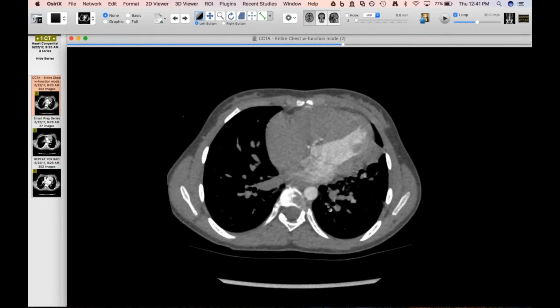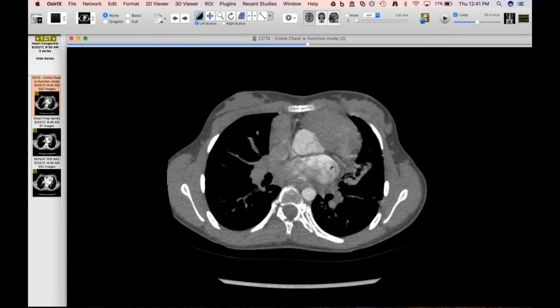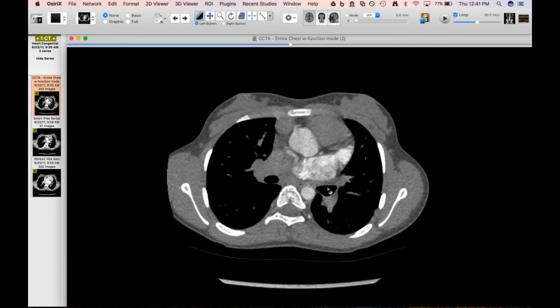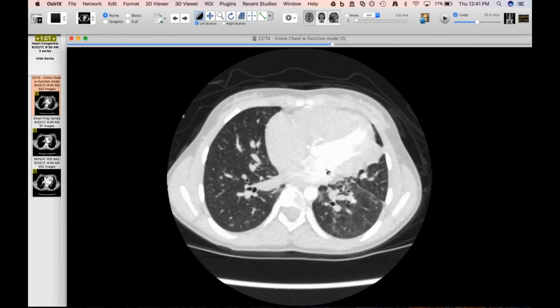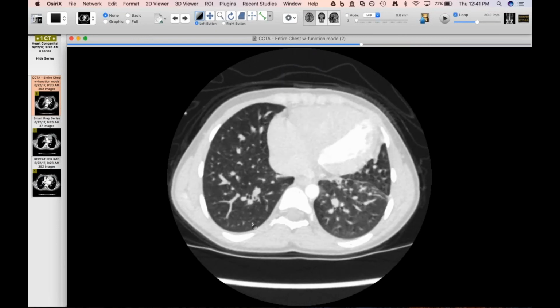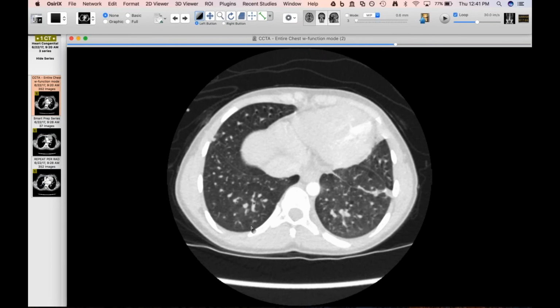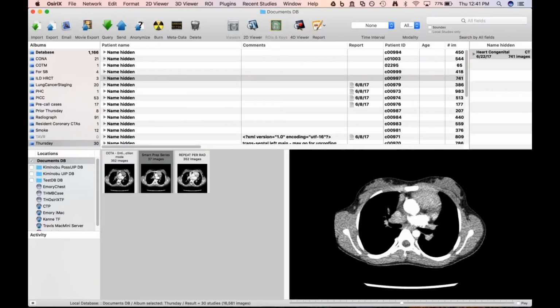But she had a transthoracic echo, not a TEE, because they obviously didn't see this on the transthoracic echo and suspected that she had pulmonary hypertension, which her pulmonary arteries are mild, but obviously we have a better explanation for why she has a frank right to left shunt.